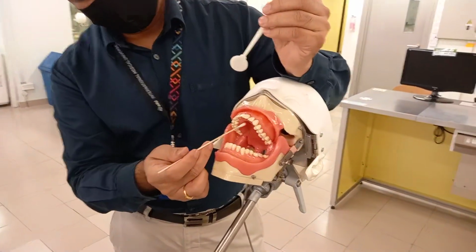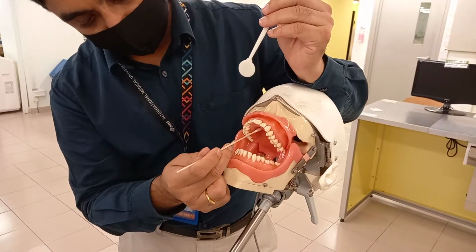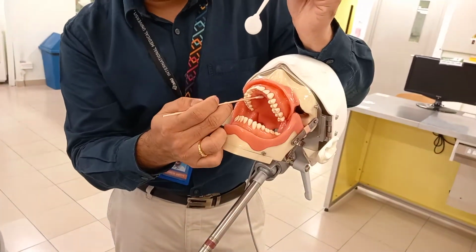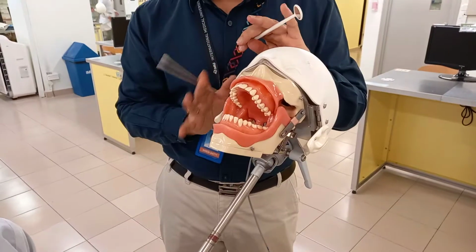Same way for palatal. Again, you dry the area. Just below the teeth here, you just apply topical. Same way. So buccally and palatally, you have to apply topical first. Then you have to wait for 2 minutes.